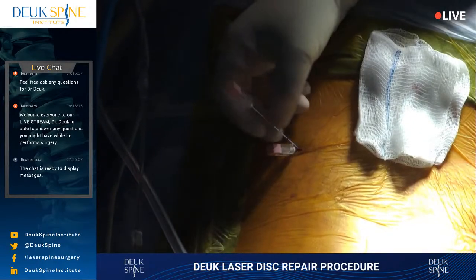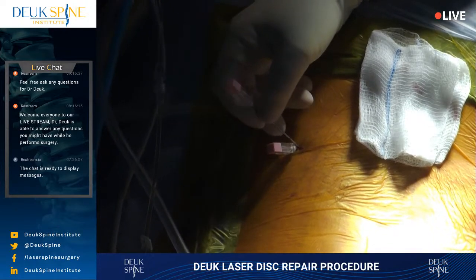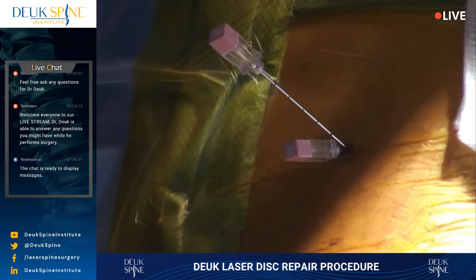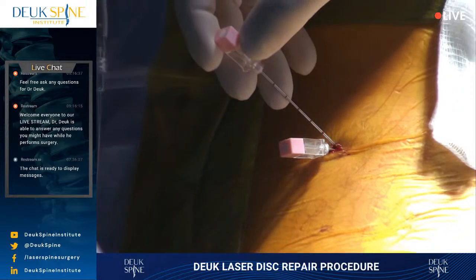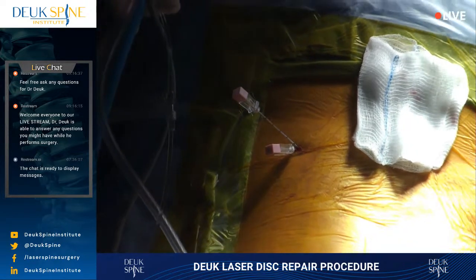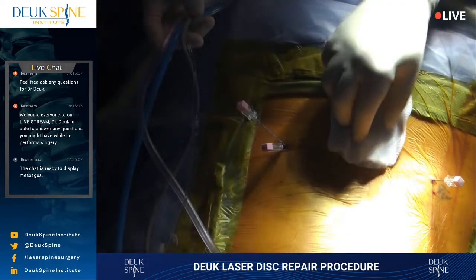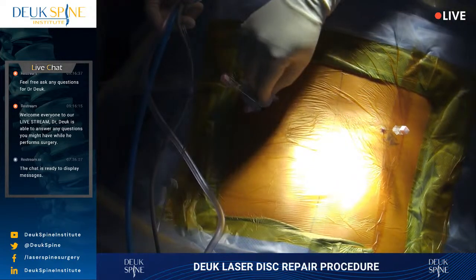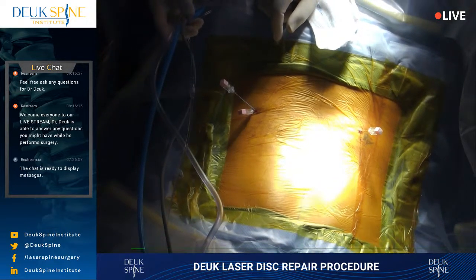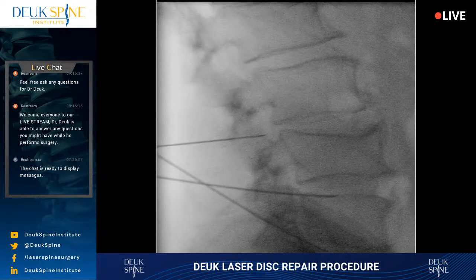All right, so I am very close, and I think I'm looking for the facet here at 3-4. So if you look at the x-ray, we've managed to place needles at 4-5, 5-1, and then now I'm doing 3-4. And that's okay to say. You feel anything there? Sarah, you feel anything there? Sarah, you feel anything? Let's avoid names. Anything there? No. All right, let's get an AP, please. So you can see the tip of the needle is in the neural foramen. And that's the beauty of the surgery, is that we're actually coming at an angle from the side, so we don't have to remove bones that are normal in the spine.